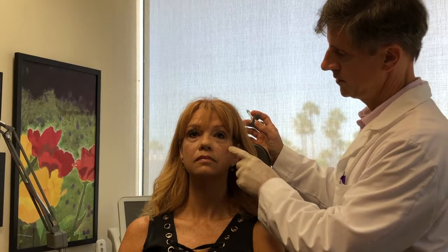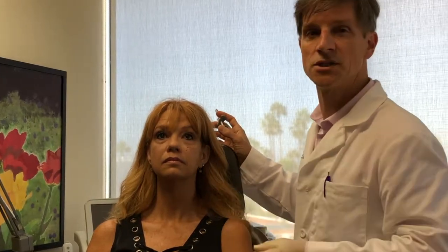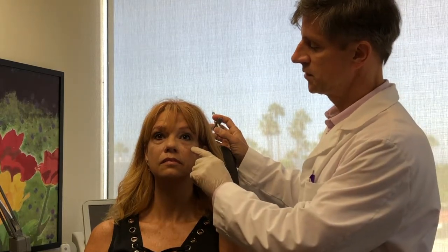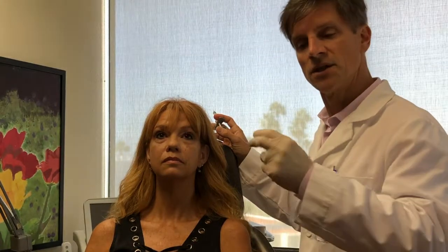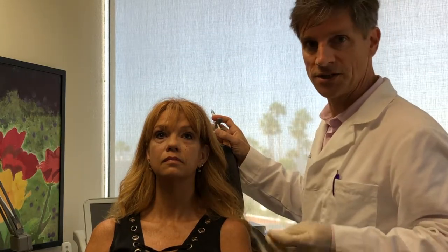Now I would like to demonstrate a different technique — more of a puncture depot technique as opposed to cannulas. Understanding the anatomy is very critical. We need to avoid the superficial malar area, as she has existing malar edema. There is both a superficial and deep lymphatic chain, and both need to be intact. Although we could come into the prezygomatic space, the deep drainage in the roof of that space could cause further compression and potentially exacerbate her edema. So I prefer to stay below that and contour the cheek.